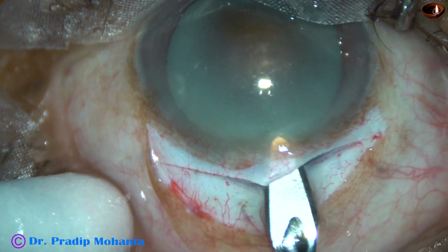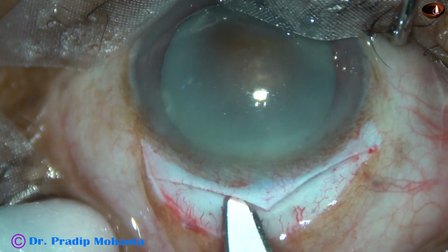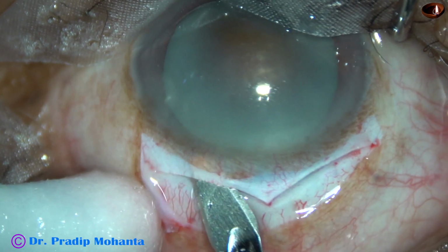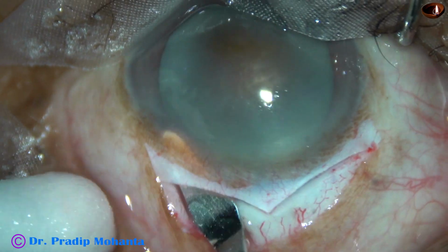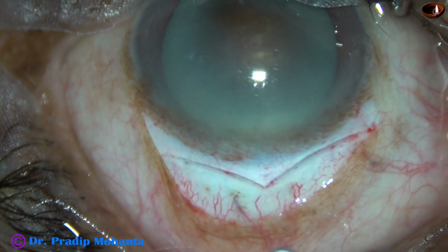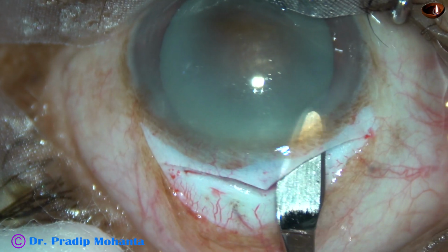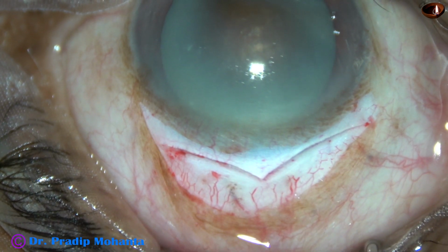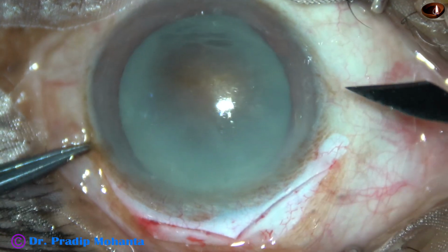This is a modification of ECCE. We used to do ECCE, and we used to place about 7 to 8 sutures if the wound was so large. But in this case, because it is a tunnel and there is a corneal valve, a very nice corneal valve, only one suture will be placed just to reduce the astigmatism. Otherwise this wound is self-sealing.